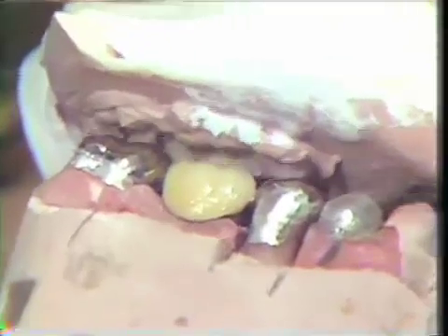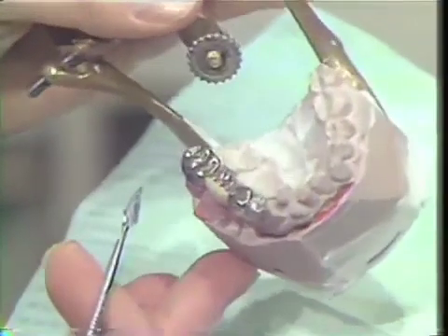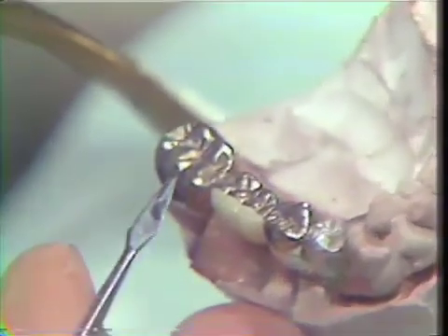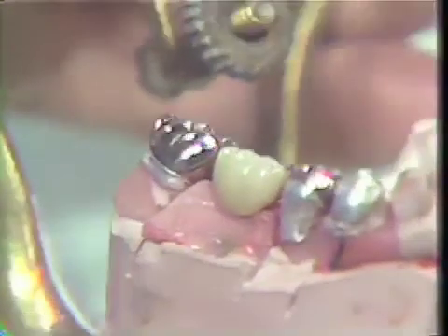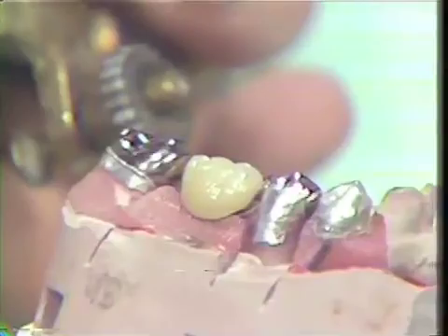We can now send this to the laboratory and have the bridge fabricated, as you can see here, and it has been checked with the stone key and also the anatomical stone cast to give us our contours. Here you can see the occlusal detail and occlusal morphology. And now, after sterilizing the bridge, we are ready to try it into the patient's mouth and check the excursions.